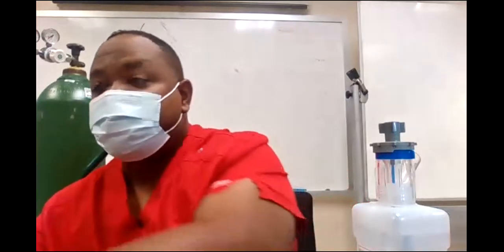So what about the heat? Some hospitals will do heat, some of them don't. Some of them say that the heat breeds more bacteria in the hospital, so some of them won't do a heat. Some places will do a heat and have a heated little thing that covers the bottle and it'll heat the water. Some hospitals do, some hospitals don't. NBRC hospital wants you to heat and humidify. NBRC hospital wants you to heat and humidify this gas.